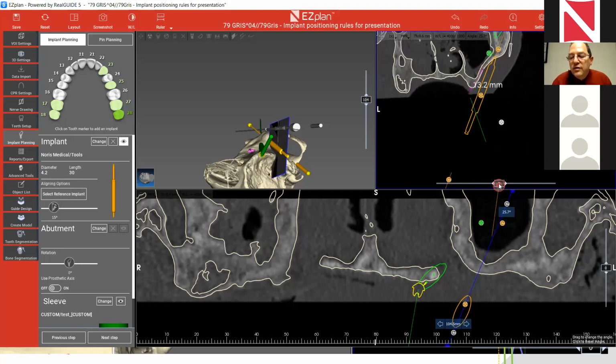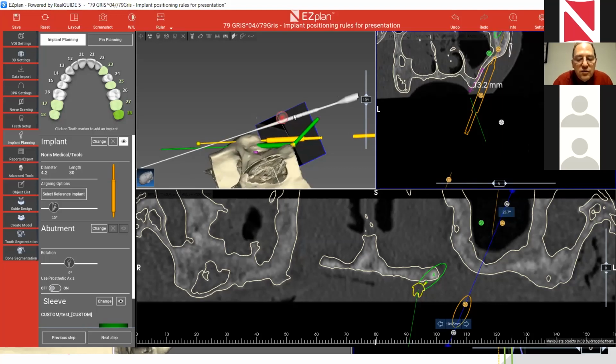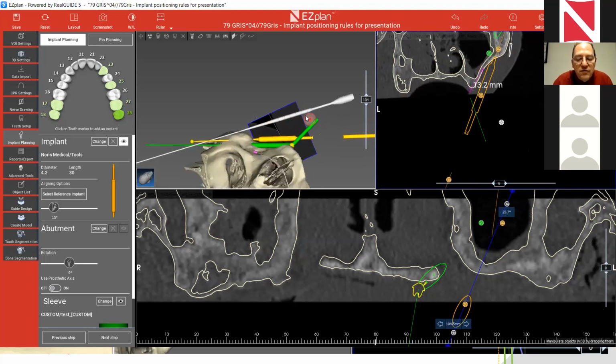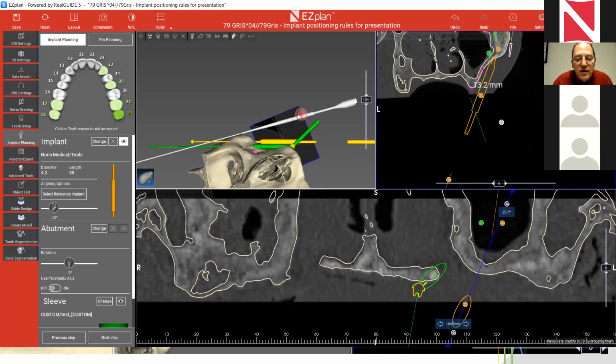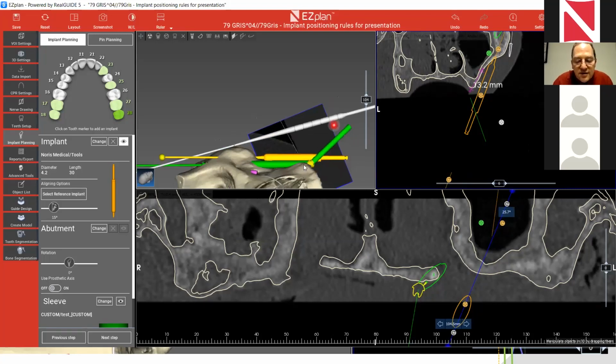No, before we grind, we put the diamond here. We come now to this trajectory, to the parallel view. And now we need to analyze: are we going to be colliding? Because we don't see any distance between them, we're actually going to be colliding in this trajectory. What do we want to do? We want to lift this line up.